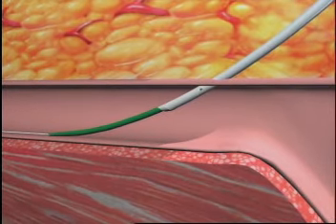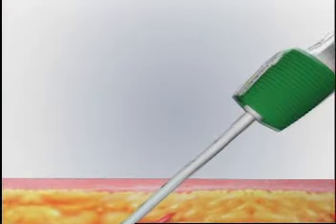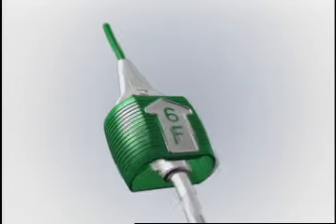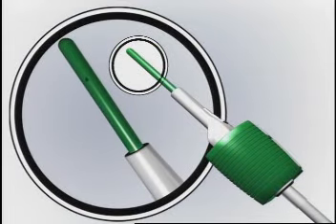Placing the holes more proximal on the sheath prevents the sheath tip from having to enter, exit, and re-enter the arteriotomy when determining proper location in the artery. A bonus feature of this change is that clinicians no longer have to think about positioning the blood outlet hole, as the arteriotomy locator and sheath now lock together in one position only. The hole will always face away from the operator.